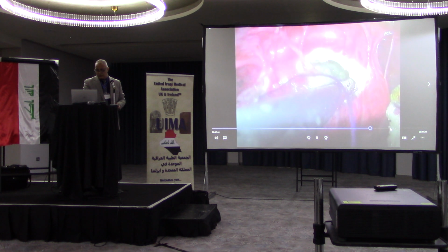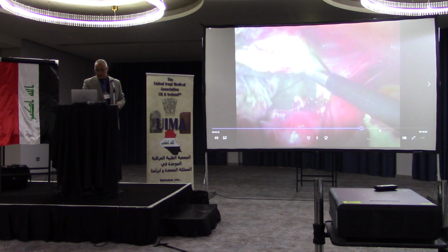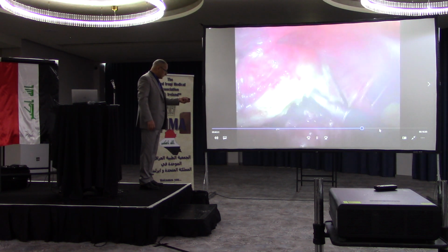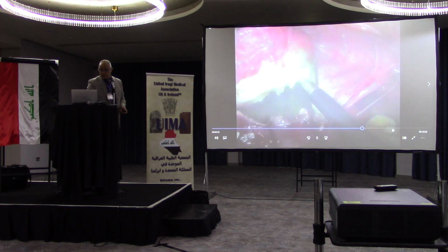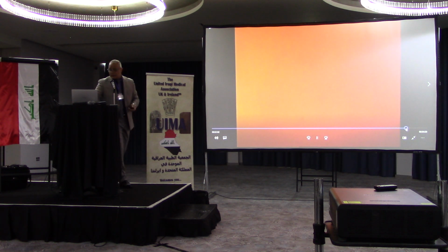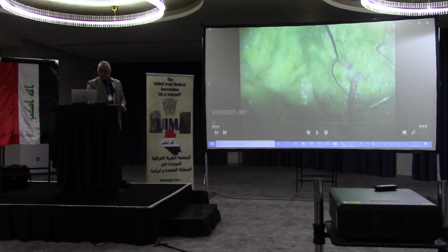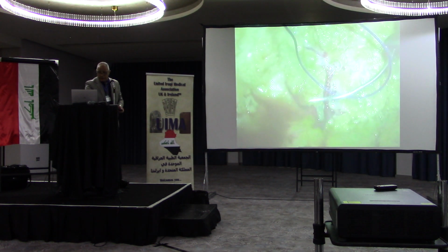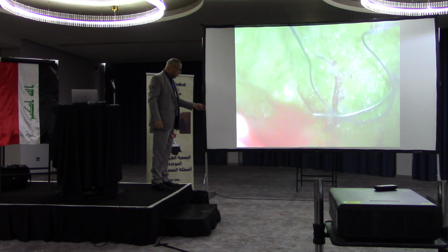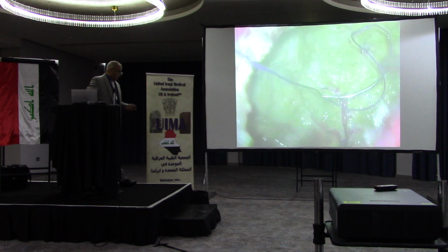This is the oldest one. Here, inside this, is another patient. I noticed a biliary connection below, so I sutured it inside the cavity. I made a figure-of-eight suture to close the biliary connection, and it did well. The patient had the drain removed. This is inside the cavity, and this side was the primary biliary connection. So I put a figure-of-eight suture to close the communication, then put the drain and removed it after a while.